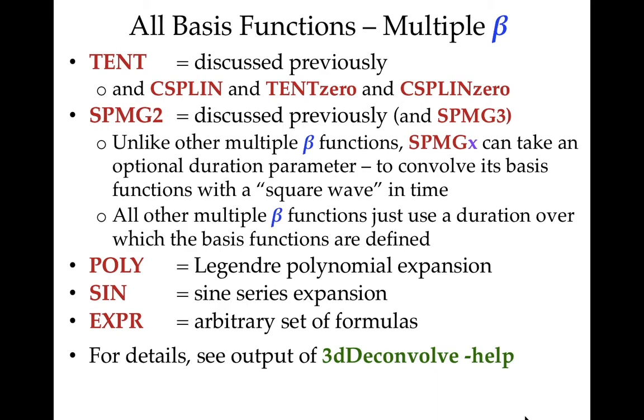And the other ones that are there are for very special advanced users. Poly, which gives you the Legendre polynomial expansion in time across whatever unit of duration you wish. A sine, which gives you the sine series expansion. And EXPR, which gives an arbitrary set of formulas. That is for someone who really knows what they're doing.